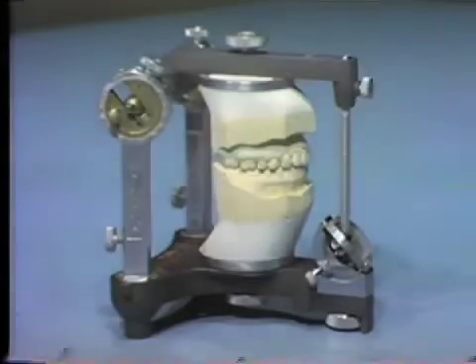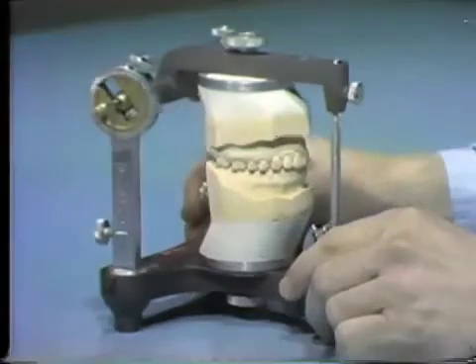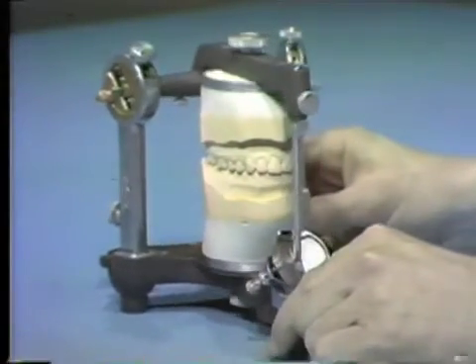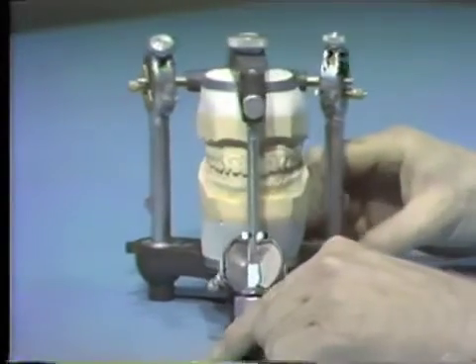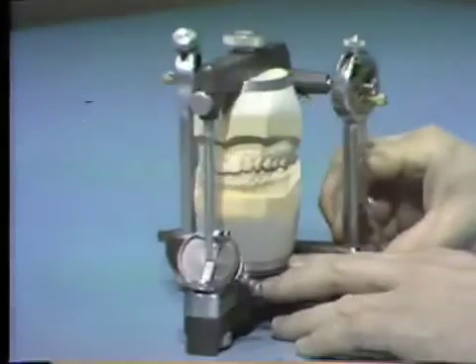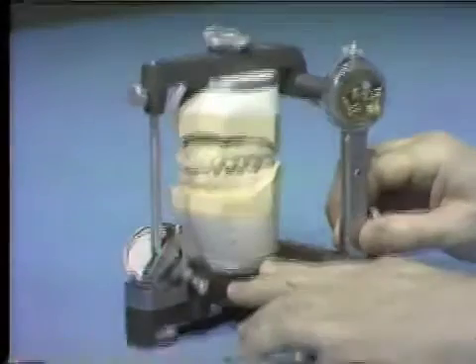Casts mounted correctly on an individually adjustable articulator provide a fairly accurate reproduction of the occlusion in centric and eccentric positions. The articulator cannot exactly duplicate the patient's mandibular movements since the condylar elements are not shaped like the temporomandibular joints. Some of the settings on the articulator are average values rather than the exact measurements of the patient.